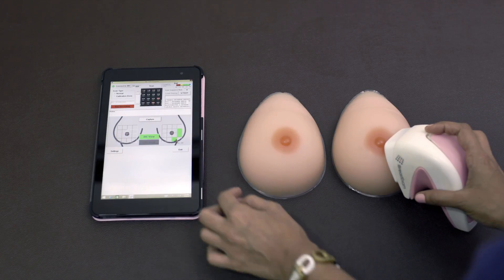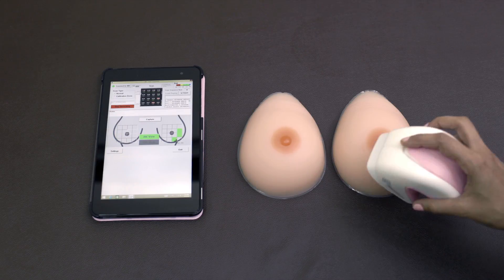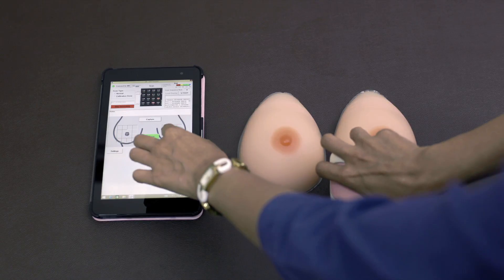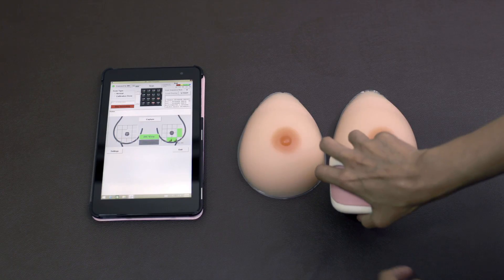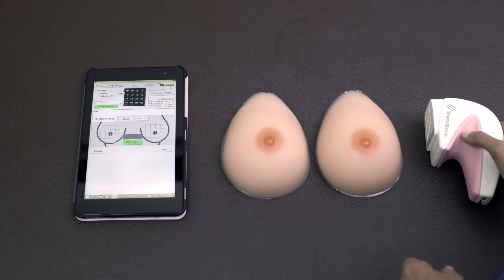Once a spot is scanned, the device is moved to another location nearby. In this way, both breasts are examined quickly within five minutes — simple, quick, and painless. Once finished, the operator will be ready to print or email the test report.